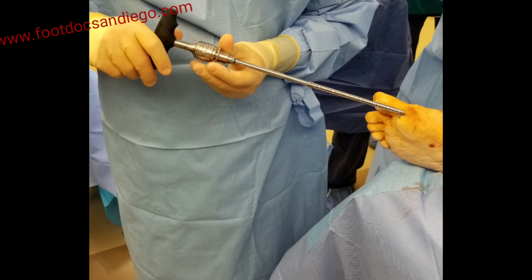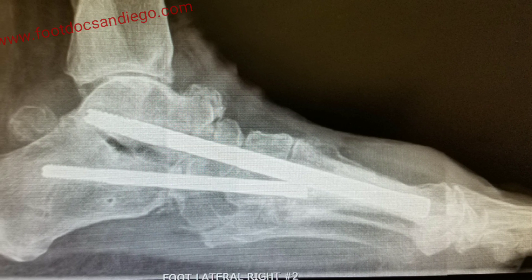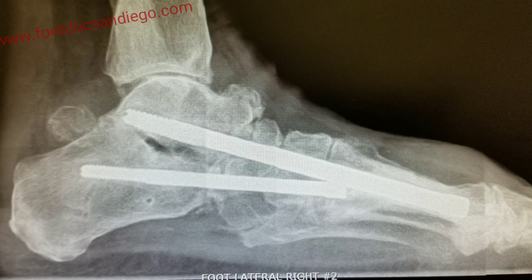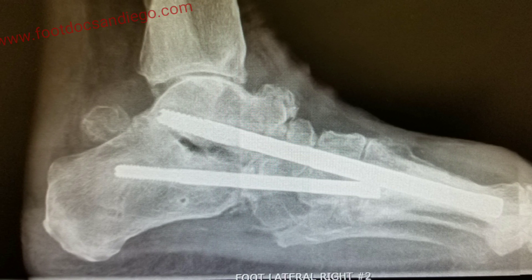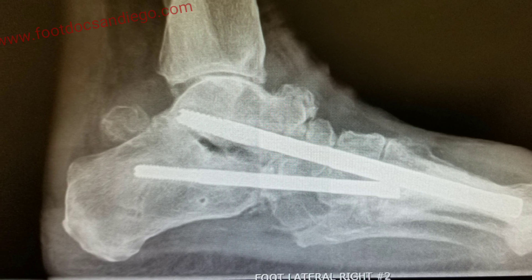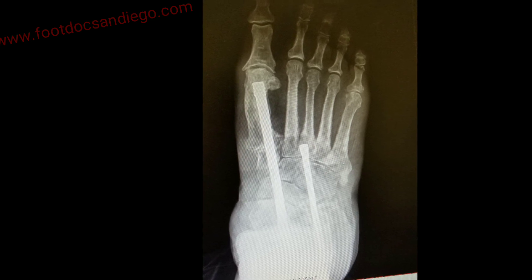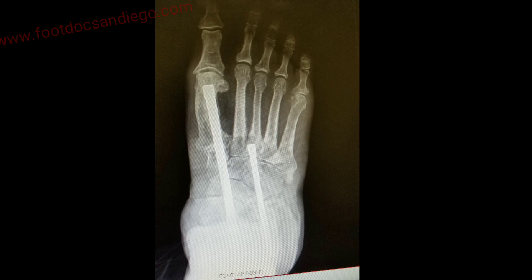Once the frame was removed, a medial incision was made to denude the cartilage from the medial column joints, then the G-beam was inserted. Here we can see on radiograph post-insertion of the G-beam with Méary's angle down to zero and a lateral column beam. What's interesting about this case is that once the medial and lateral column beams were inserted, the calcaneus was in a rigid position with no valgus or varus motion. The decision was made not to fuse the subtalar joint, as the locking of the medial and lateral columns in essence locked up the subtalar joint as well.